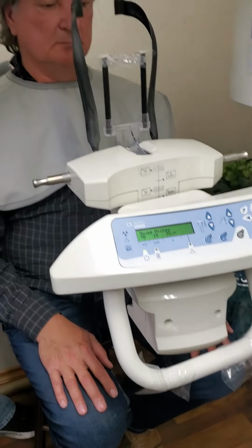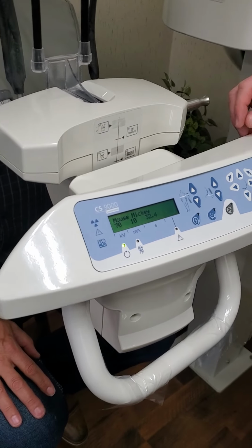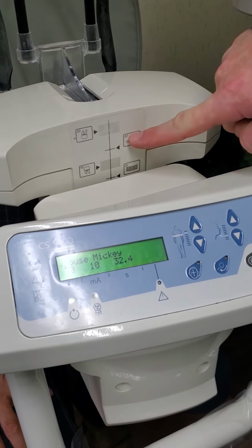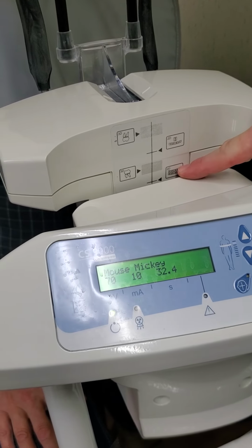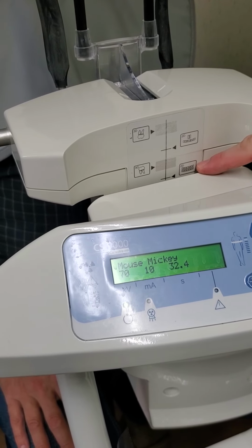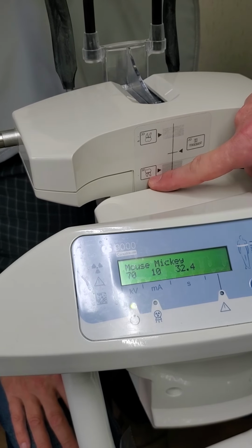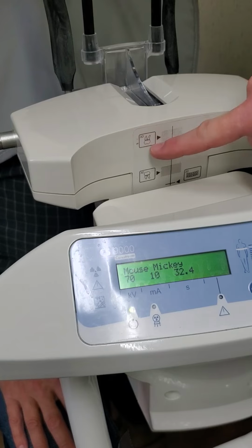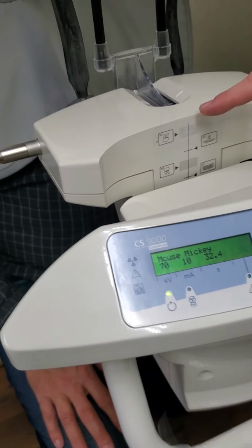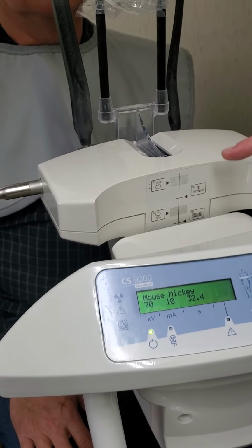Okay. Now the setting that we use for the CBCT, you can see on here, this says 2D and 2D. This is two-dimensional. That's going to be your pano setting here. This one says 3D and it's got a lower tooth on it. This one says 3D and it's got an upper tooth. This will determine where you position your chin rest to capture this particular CBCT image.